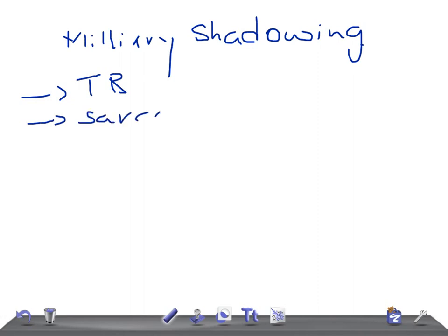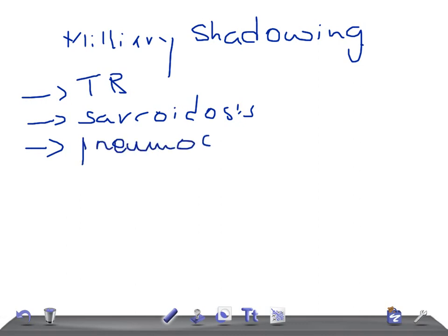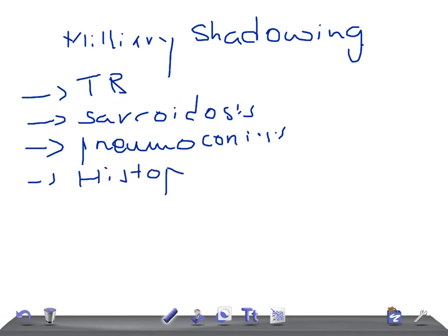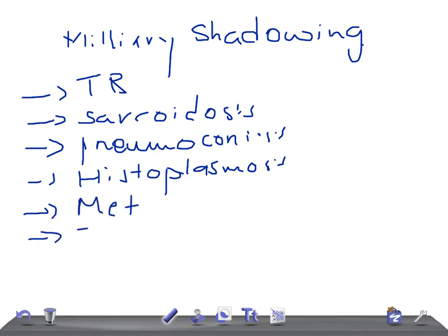This is a kind of revision for you for your USMLE or any other medical or intensive examination preparation. The causes include sarcoidosis, pneumoconiosis, histoplasmosis, metastasis, and chickenpox.